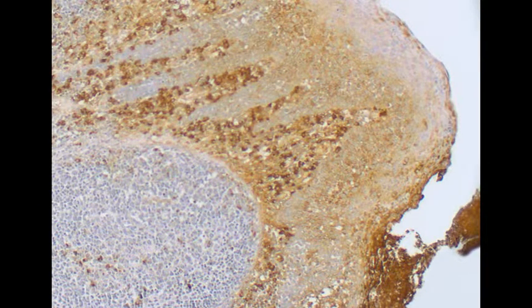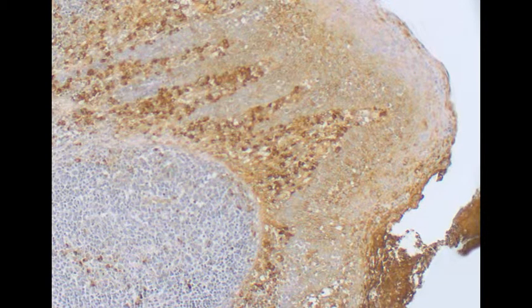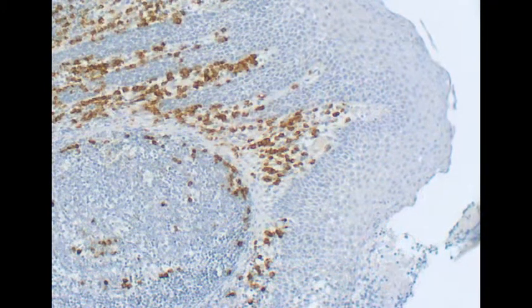What you're looking at on your screen right now is two serial tissue sections of normal human tonsil. The first, which we ran a Kappa IHC antibody on, and the latter, which we ran a Kappa ExISH probe on.